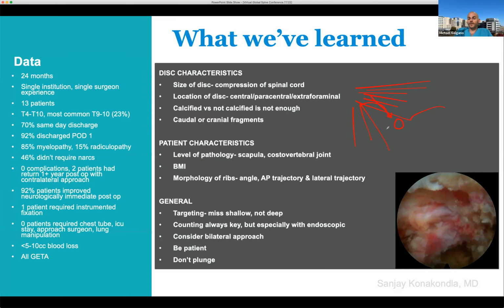Question. Go ahead. Sorry to interrupt you. Is there any particular type of disc that really is too much of a reach for this endoscopic approach? When you just showed a variety of different disc herniations, calcified, non-calcified, that you've taken care of over the last couple of years or so, some of them look like really nasty cases, and presuming you did all of them endoscopically, is there anything that you would feel is really too dangerous for the endoscope?